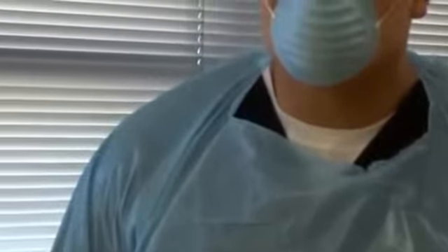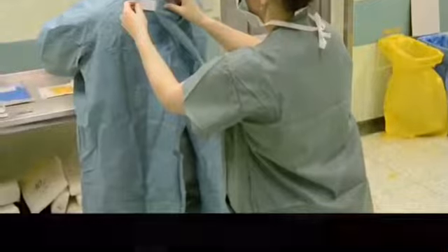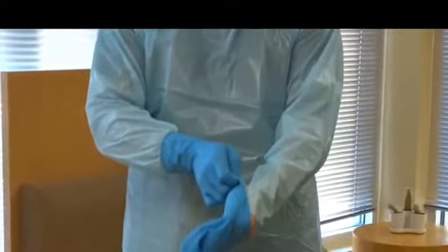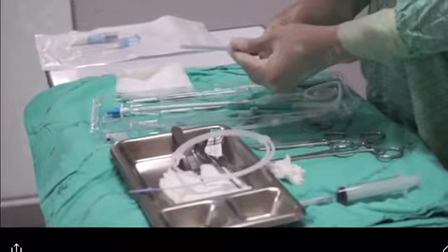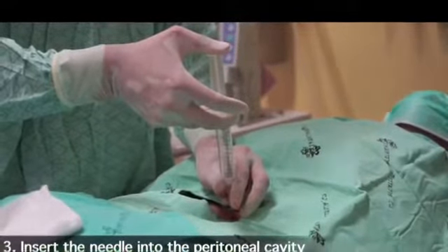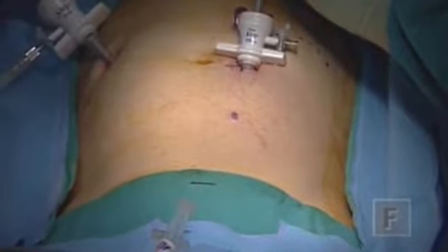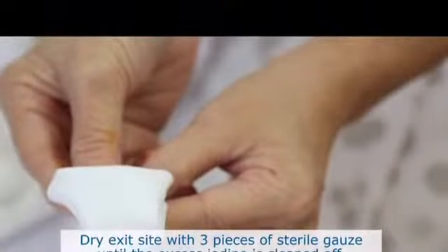Postoperative care of the patient. The goals of post-insertion care are to prevent colonization during the early healing period of 2 to 3 weeks and to reduce bacteria at the exit during later healing, to minimize catheter movements to prevent trauma to the exit and cuffs, and to promptly diagnose complications. The principle of post-implantation care procedures is to restrict postoperative dressing changes to trained staff. Frequent dressing changes during the first 2 weeks are not necessary unless dressings are wet, and limiting dressing changes decreases the risk of contamination and minimizes catheter manipulation and subsequent trauma.